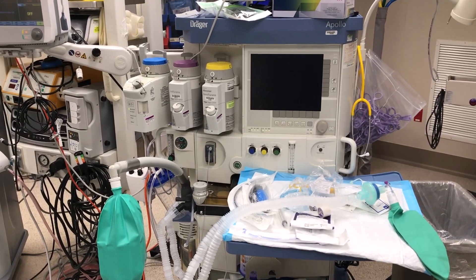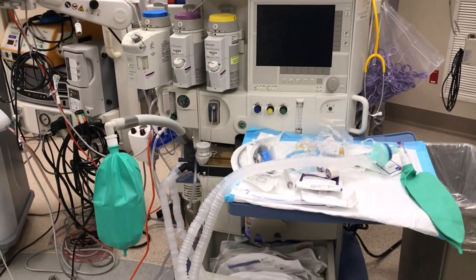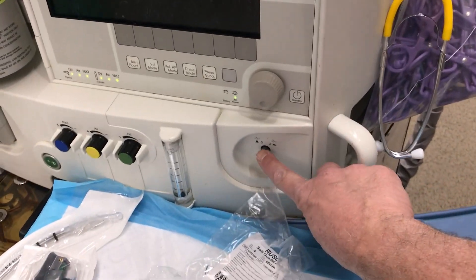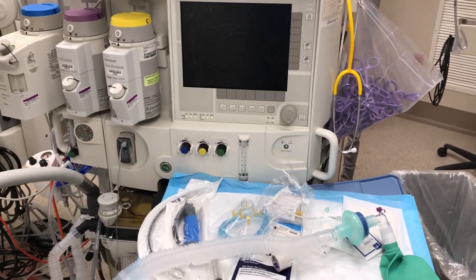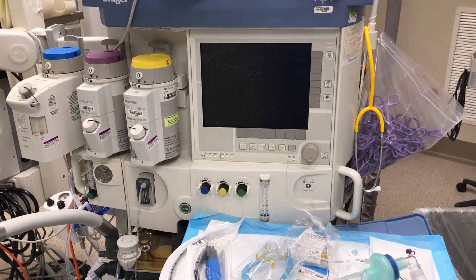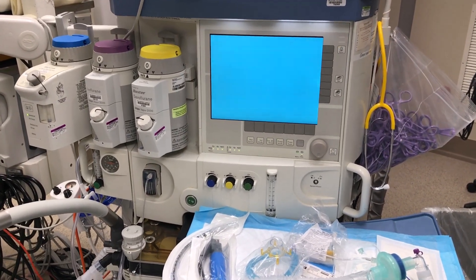This is a short video on the anesthesia machine, Draeger brand model Apollo. It could also be used as an ICU ventilator. The machine has a power button and it takes a few seconds to power up. You could opt to run a self-check test or not — we will assist on the self-checking.